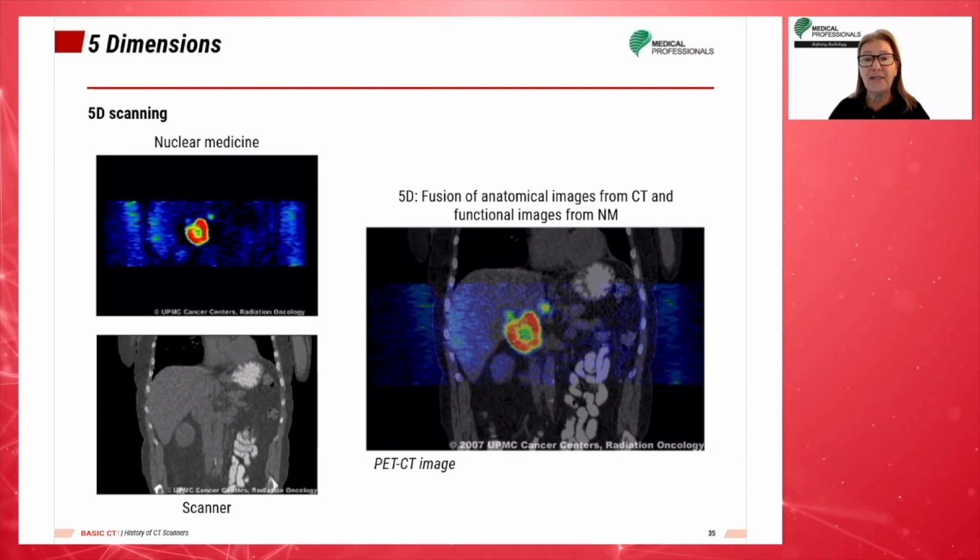A typical example would include dynamic cardiac CT scans and/or gated cardiac MRI acquired at 3 monthly intervals and dynamic cell growth and shape change at weekly intervals.